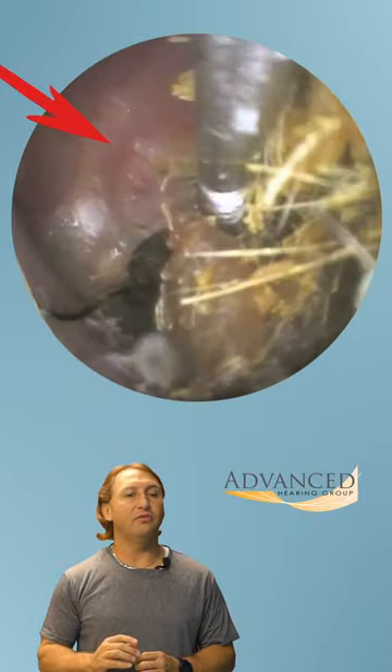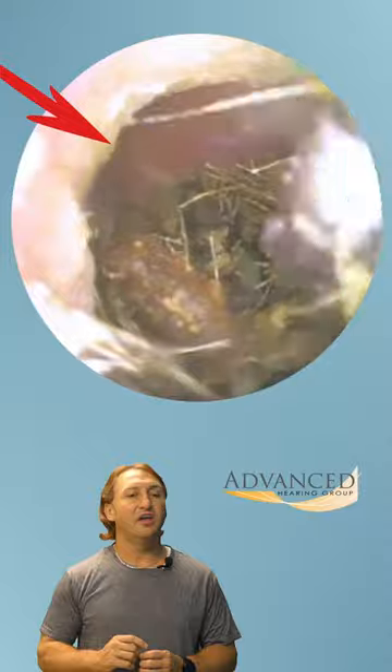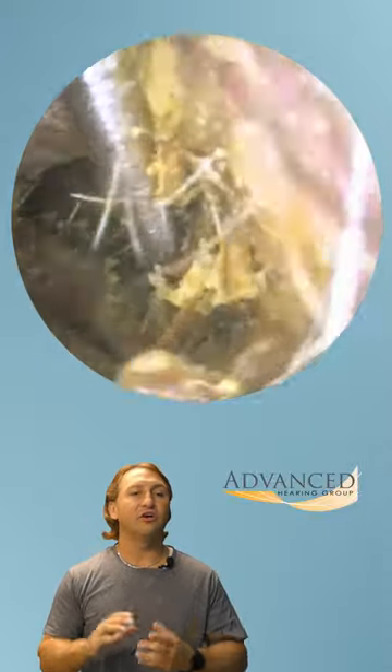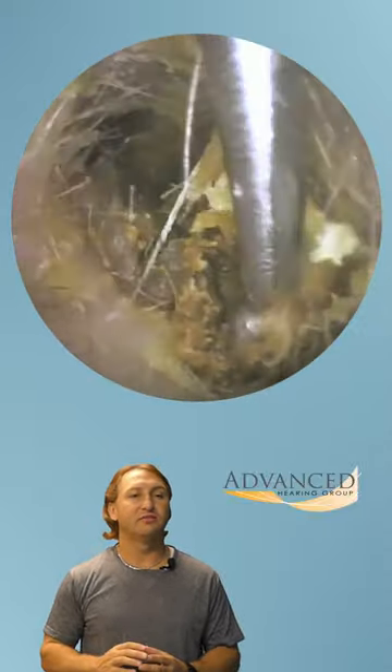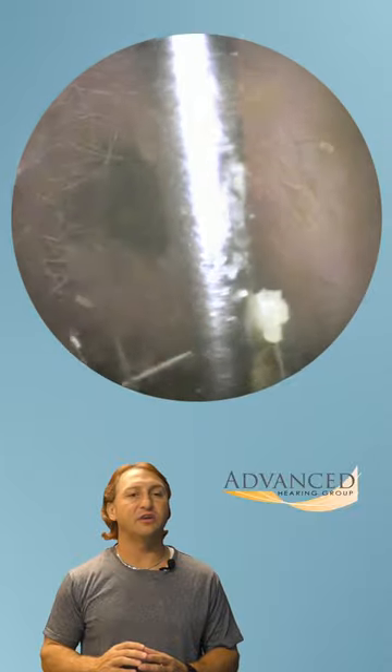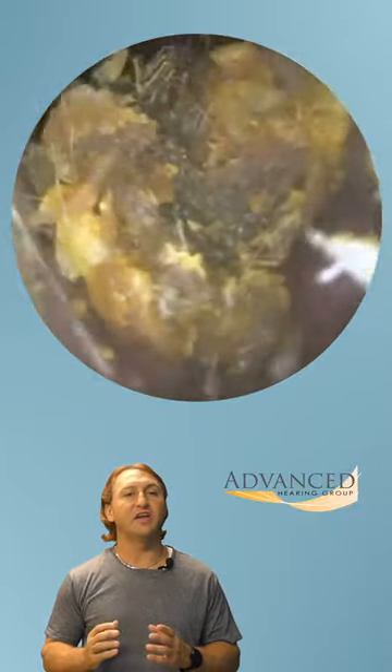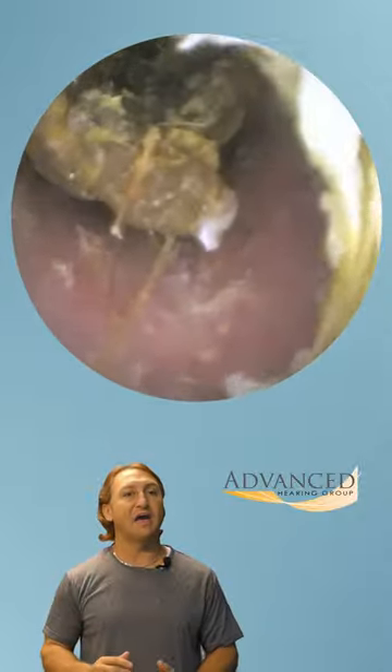And then as we pull it out — see it, there it is. As we pull this earwax out, we're going to notice that the earwax actually falls back in off the roof and covers up the eardrum again. And here that comes out — that nice big chunk — and then we'll take a look back in the ear. Again, that wall of wax is back.